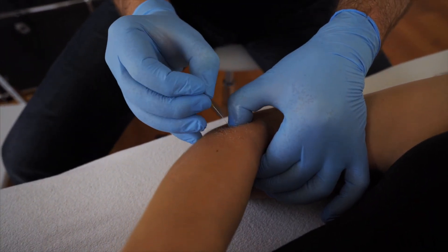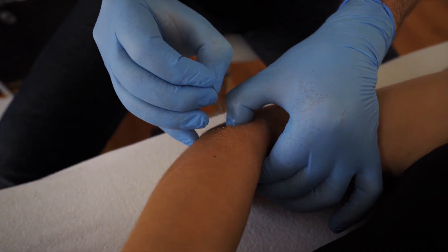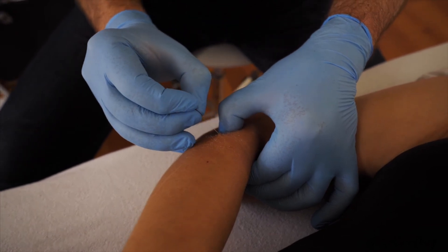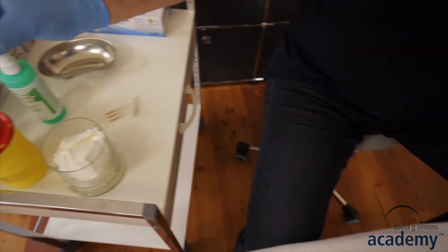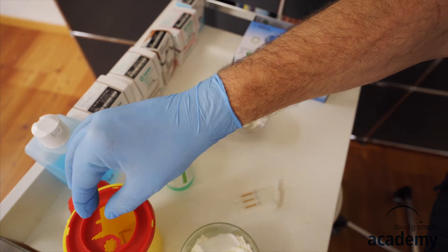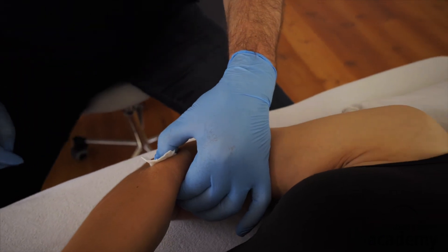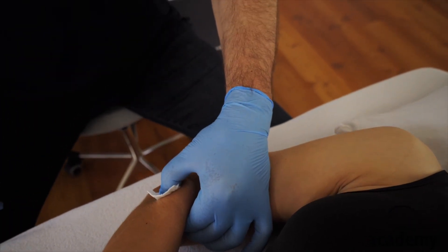Now you do the coning or the sewing machine technique — I will talk about that in another video. When your needling is finished, take the needle out and dispose of it in the needle collector. In case of bleeding, take a swab and compress the needle site for at least 30 seconds.